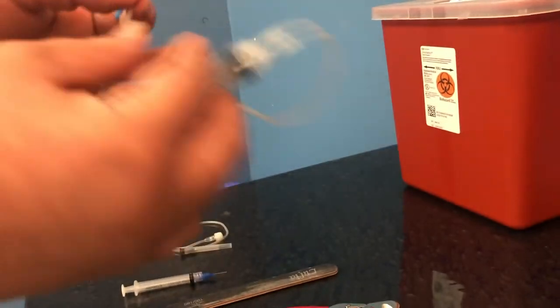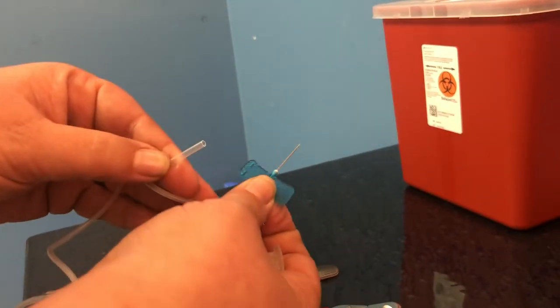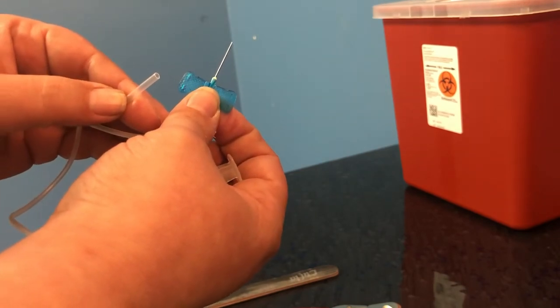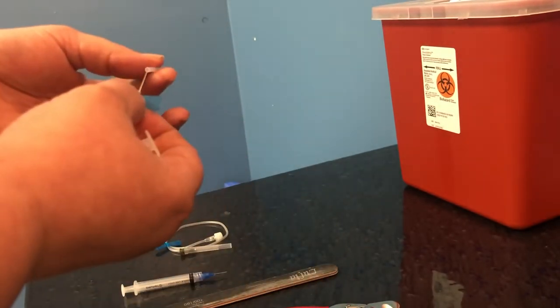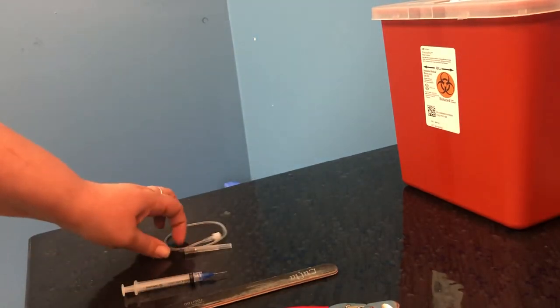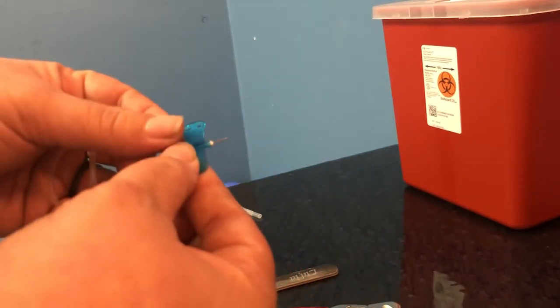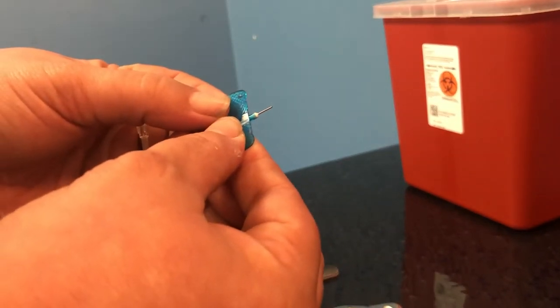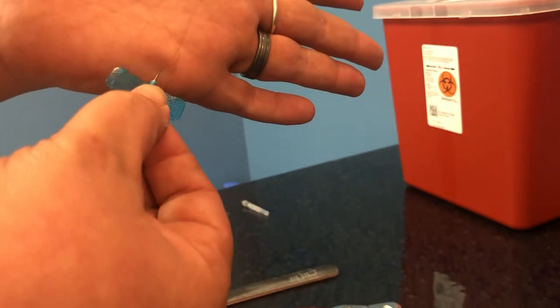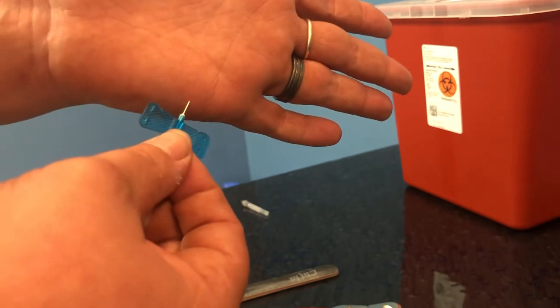So with these butterflies, when I take this cap off, you're gonna see this is also a sharp needle, just like the one on the syringe was, but I can convert this into a training needle myself. And you can see, here's one that I've already converted. You can see that it's shorter and that it is more blunt. And if I test this on my hand, you can see that it displaces a fairly small surface area. It's a pretty intense stimulus.